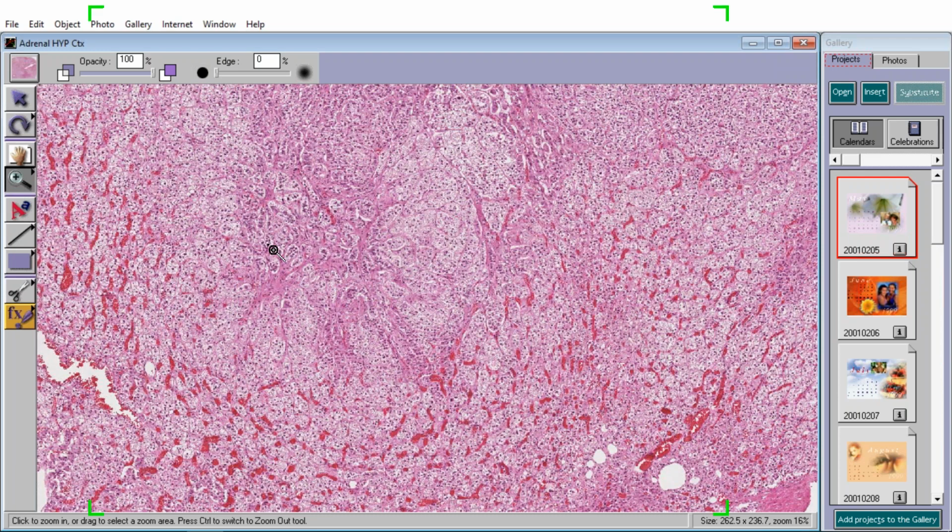So what would you call the cells of the adrenal cortex if they were increased in number? Well, you call that hyperplasia. And this is a classical example of hyperplasia. Could this patient have had perhaps a pituitary tumor that was producing ACTH? Yes. Could the patient have had other influences causing this? Yes. I'm going to blow it down again a little bit.